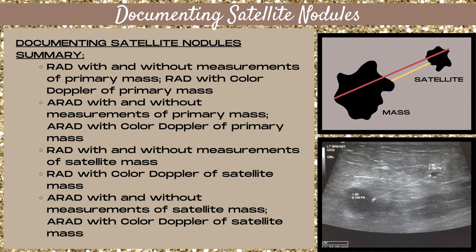Follow these same steps for each satellite mass. Take a radial image with and without measurements of your satellite mass, a radial color Doppler image of your satellite mass, an antiradial image of your satellite mass with and without measurements, and a color Doppler antiradial image of your satellite mass.